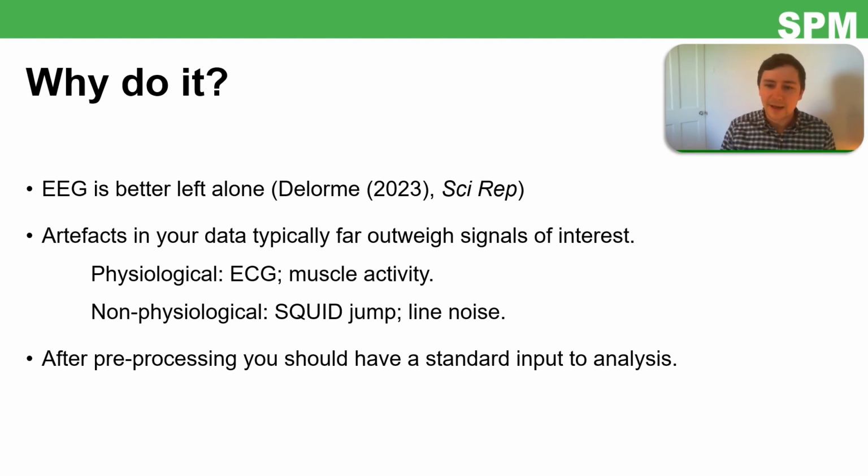Okay, so these artifacts often have a design of their own. They're not just randomly distributed throughout all of your conditions. It might be the case that sometimes there's more of an artifact in one condition than another.